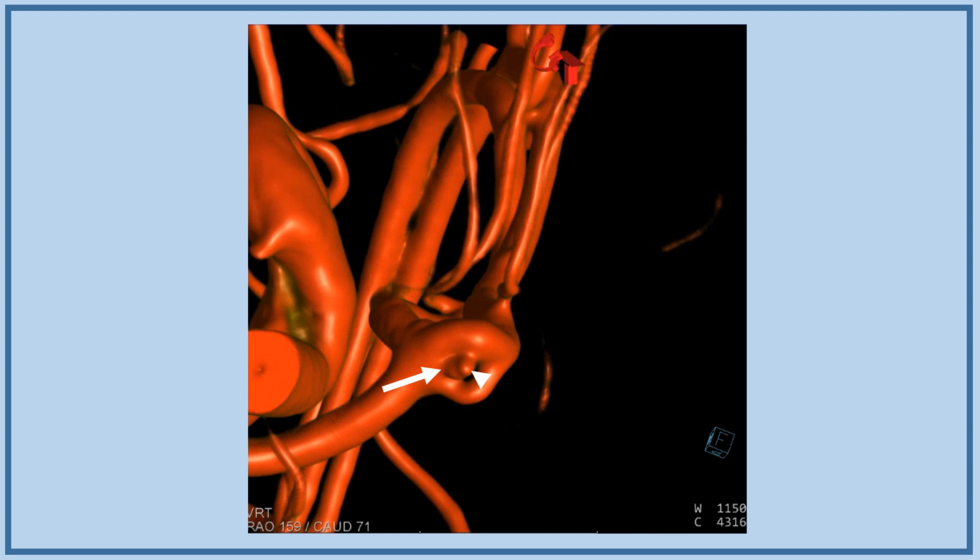And that's something that really is, first of all, obviously unusual, but it's also remarkable, the degree to which we can appreciate all of this anatomy with modern technology. This is the latest, or, well, not the latest. Now there's another later version of, in this case, the Siemens technology that we're using here, and that allows us to really appreciate this anatomy very, very well.